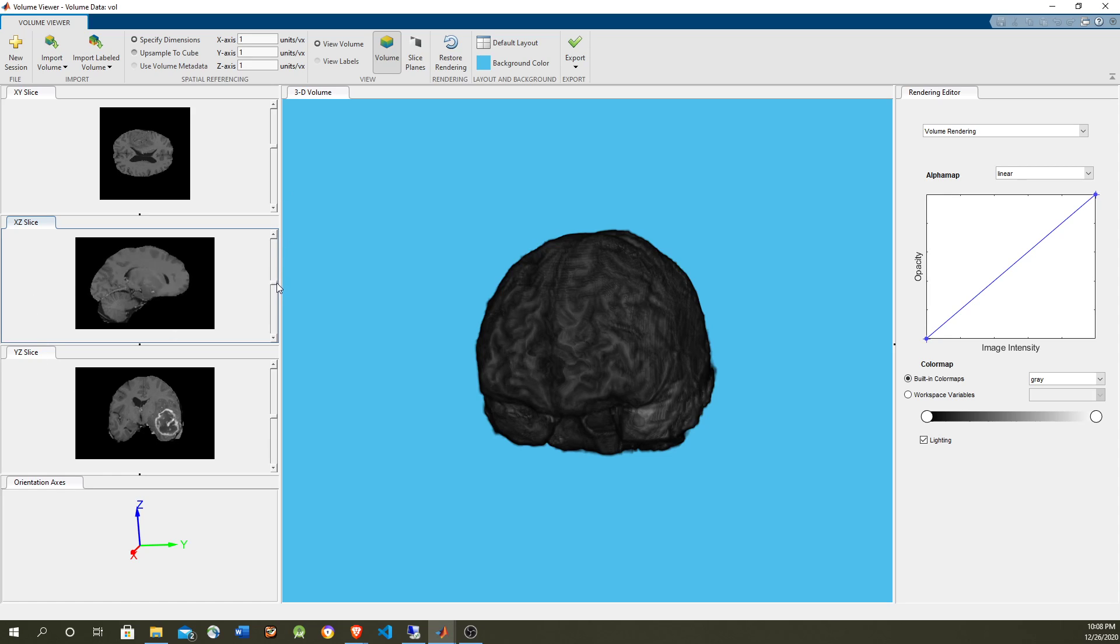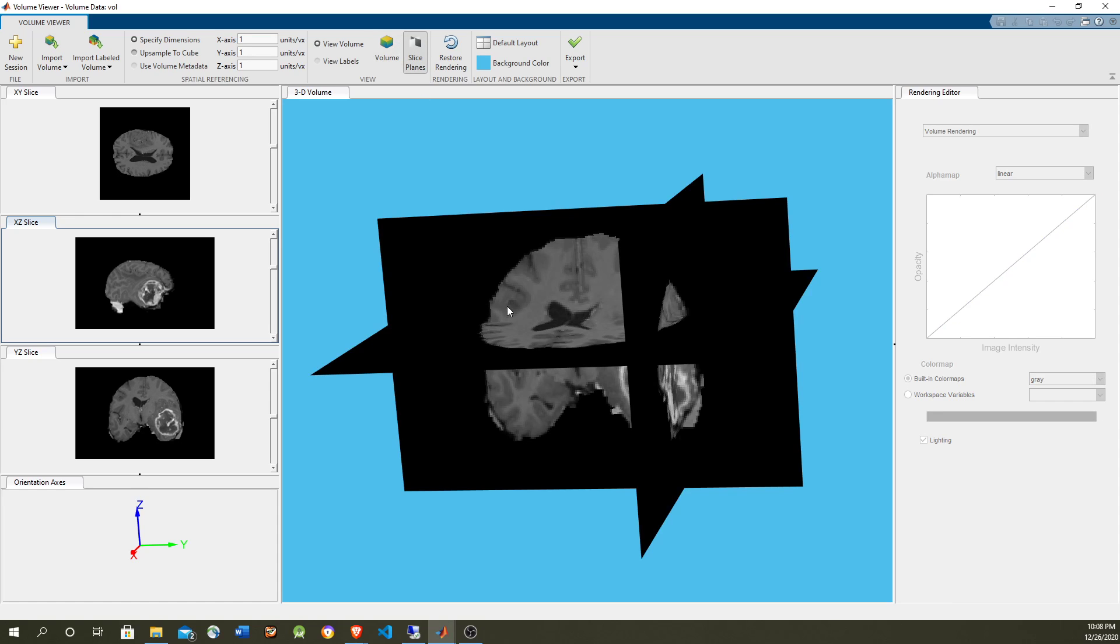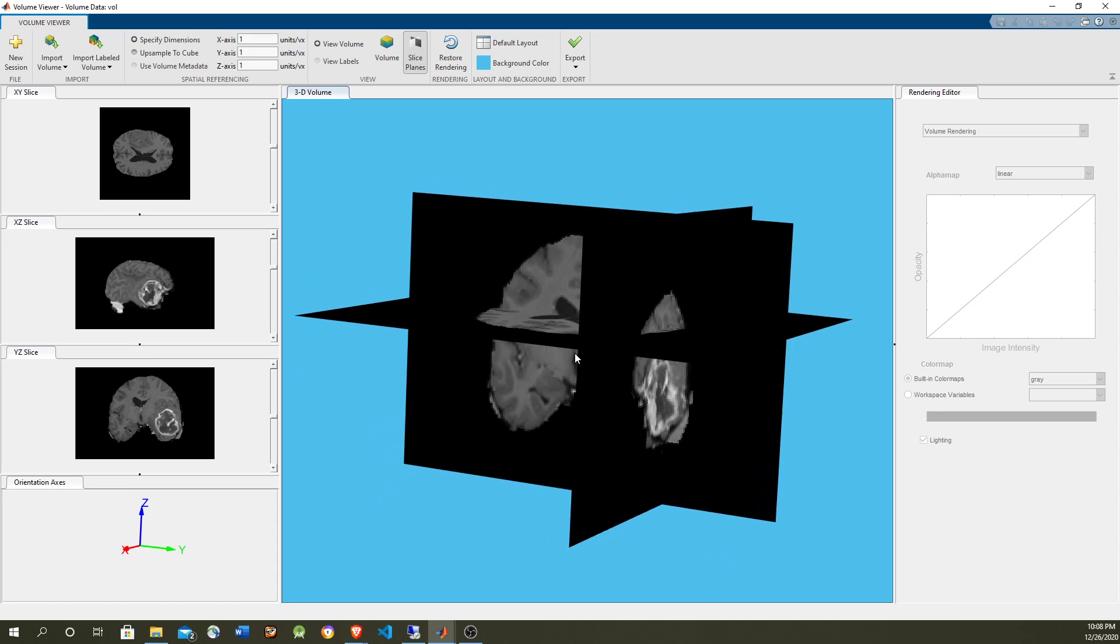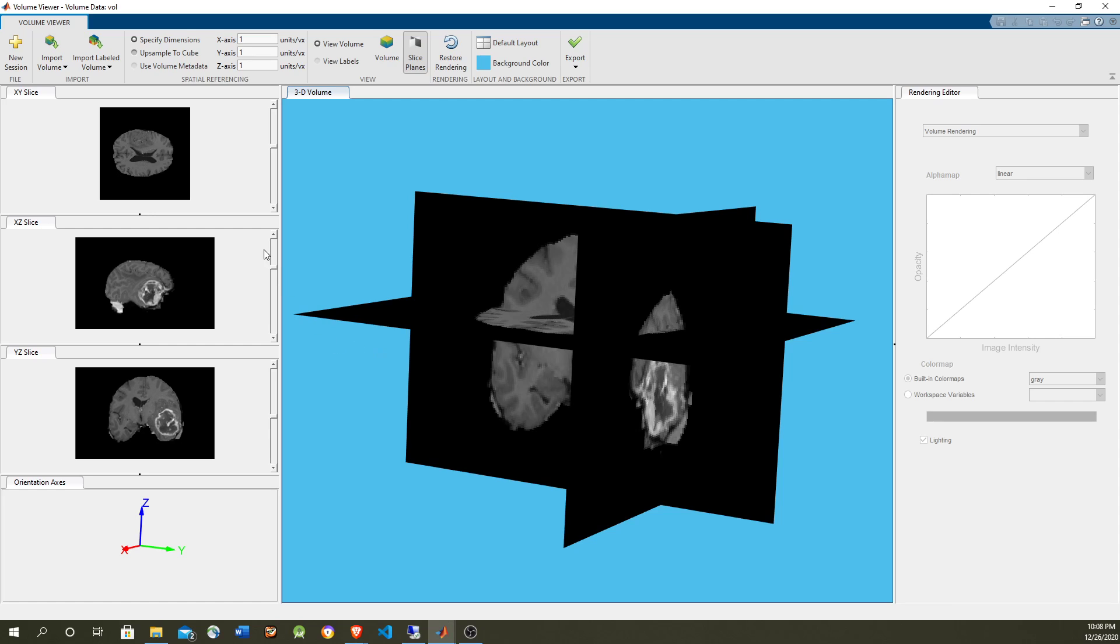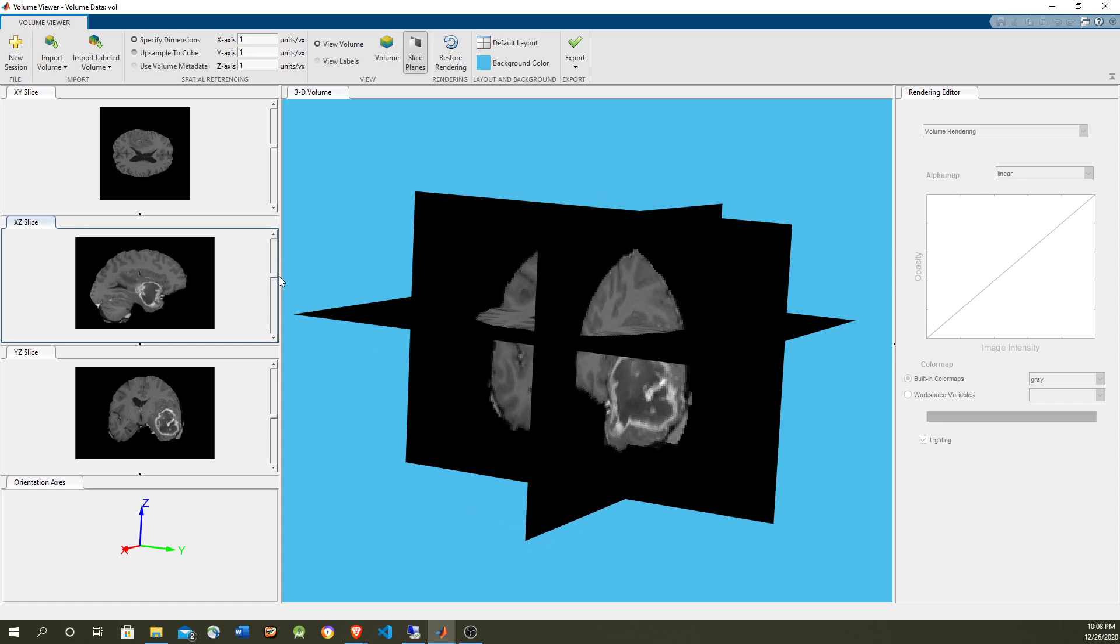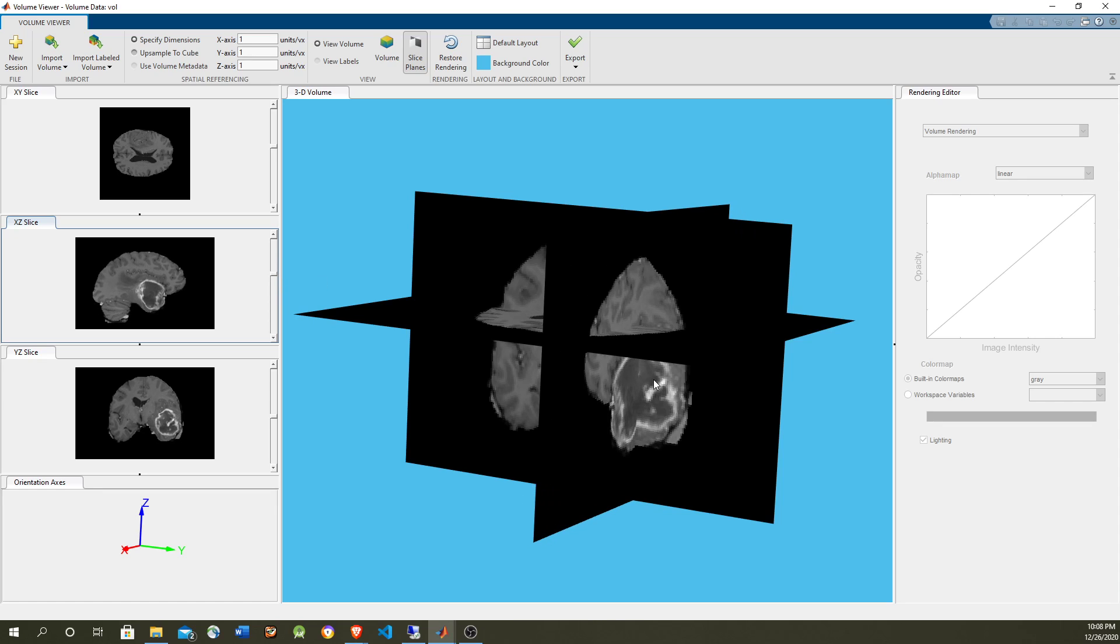If you want to see where the slides correspond to, just select slice planes and you can see where the slides belong. You can see a tumor here that we want to mark.